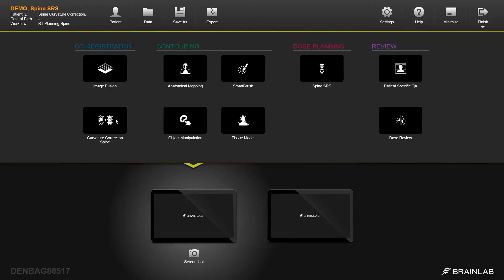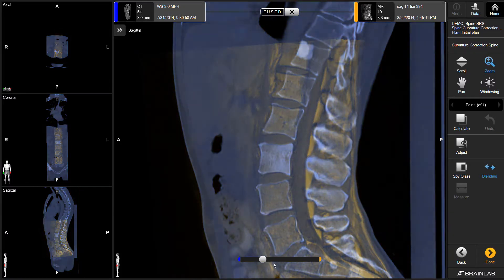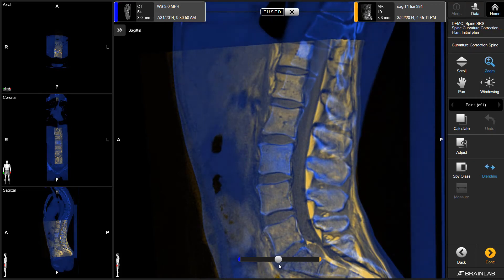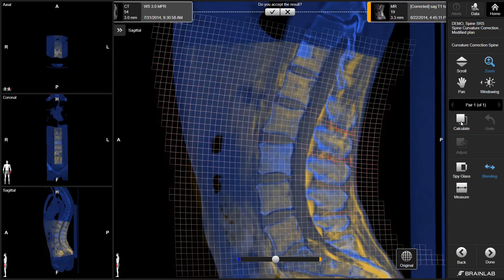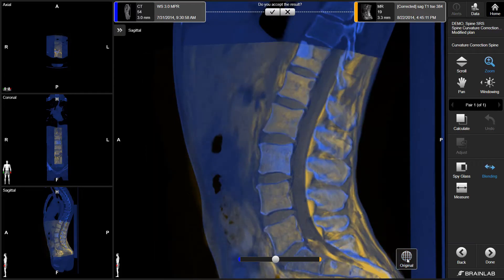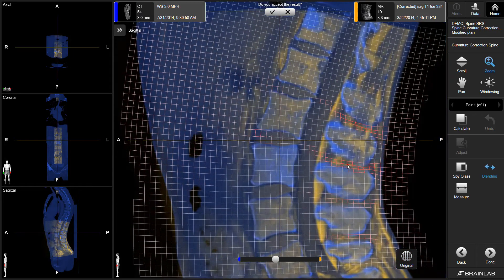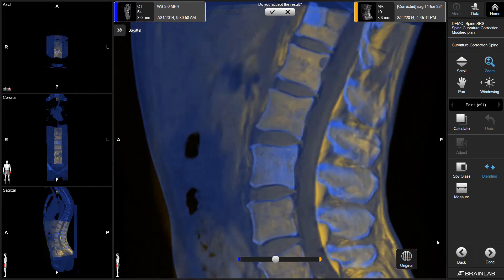Element Spine Curvature Correction applies automatic elastic fusion, tailored and validated for multilevel vertebrae coregistration to compensate for different spine curvatures. With just one click, individual fusions per vertebrae are applied, enabled by Thorough Tissue Classification to prevent bone deformation and match MR-to-CT or CT-to-CT scans.